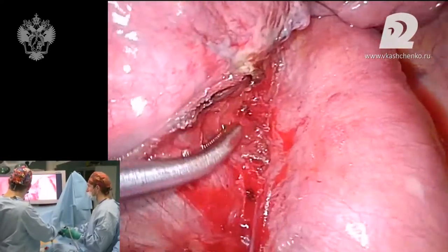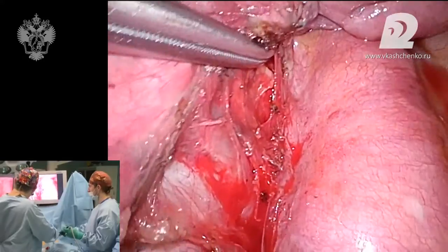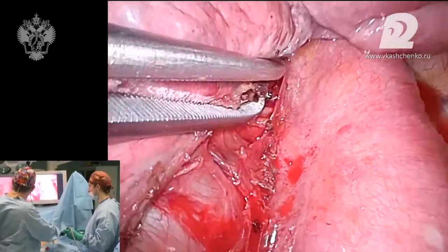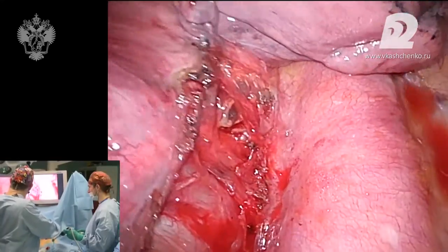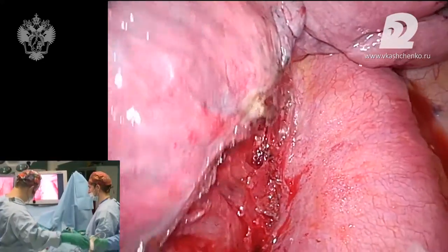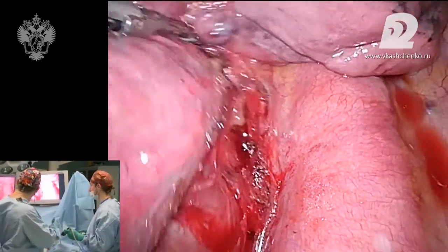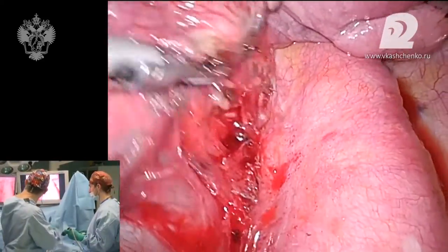And this is exactly the bundle which we could see in the endosonography, and which our ultrasound specialist decided is not very nice looking, but it's not changed or impaired. I don't know whether I handled your question or not.